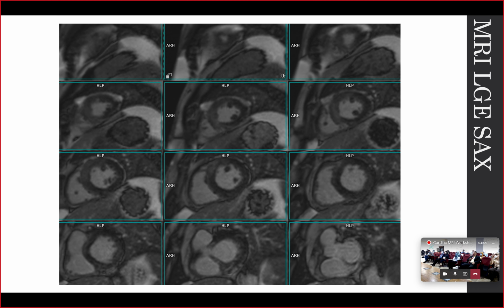So during the MDT, as a matter of fact, at the beginning, we started thinking about the coronary spasm again. But when the clinicians mentioned the dog attack, we started thinking about atypical Takotsubo. Takotsubo. Yeah. And that was the correct diagnosis. So the patient had a Takotsubo. 10 days later, everything had improved and there was no edema. And this was a case of atypical Takotsubo.